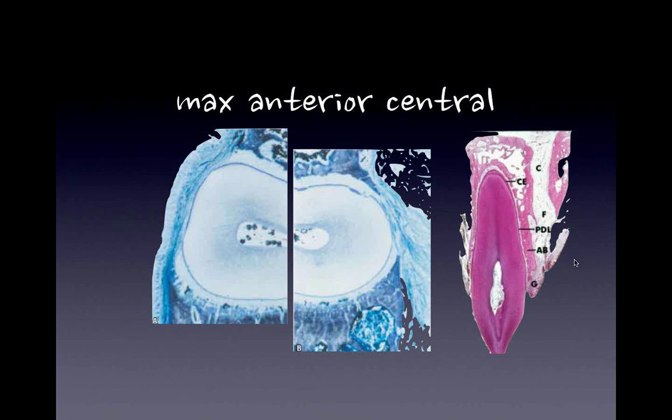What's the thickness of the composite in your guides? Good question. I'm not measuring it, but if I did, I would say it's about a millimeter and a half, 1.5. I think that's a good number to measure to see if you have translucency. But that's a good idea. I'm going to go back and measure those.